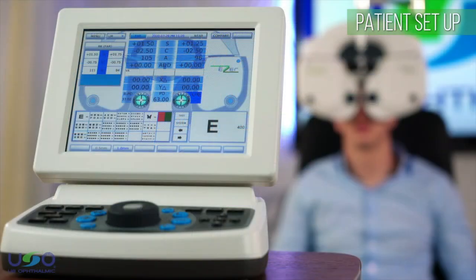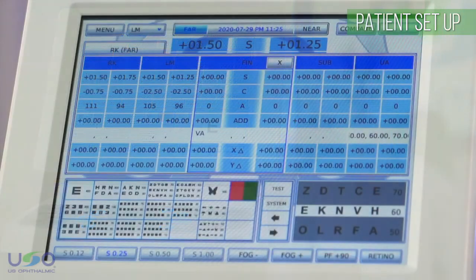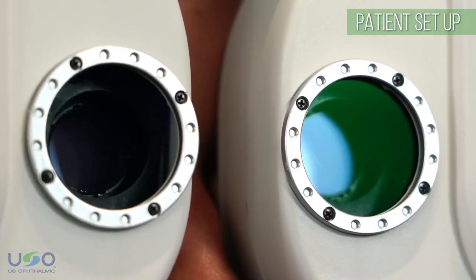Once the final prescription is obtained, you'll have the ability to immediately create an automatic comparison between the patient's previous prescription and their most updated one. Such an efficient and instantaneous comparison cannot be carried out with traditional manual refractors.